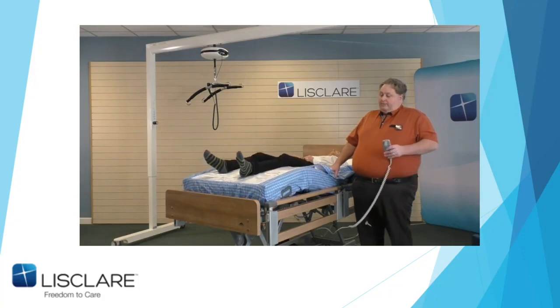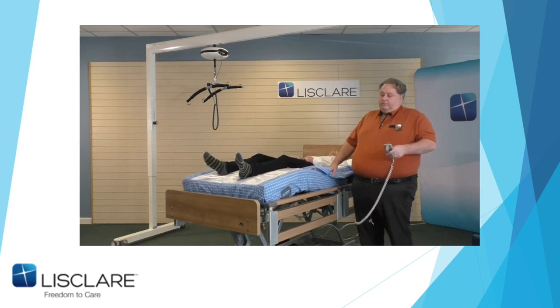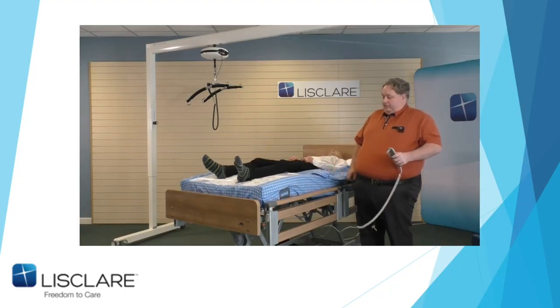And if I want them to rise, what I'm creating is actually a slight slide, but then when I lower that down, you'll hear a few clicks. And you should hear another one. There it is. So when I press up, it elevates the legs slightly, okay?